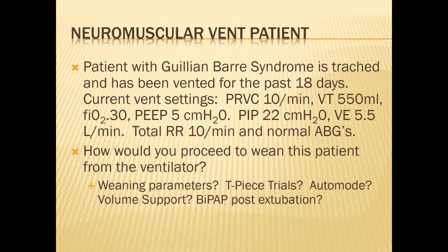Because you give it to them for maybe 30 minutes. If you see signs of fatigue, they go back on full support until either later that day or the next morning after they've been rested. Then you do it again and keep extending that period of time. Giving SIMV to wean, yes, it's accepted. You're going to see it a lot. And then the other alternative is CPAP with pressure support trials and just extend the trials as the patient can tolerate it.